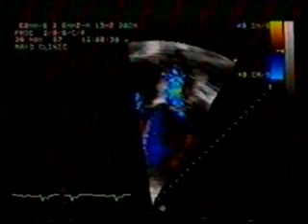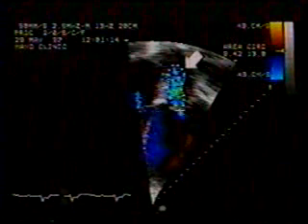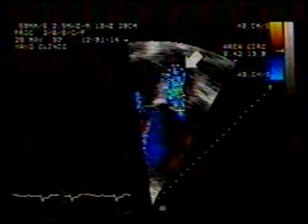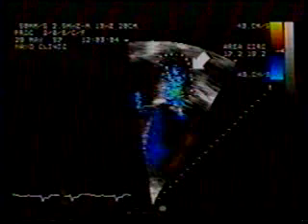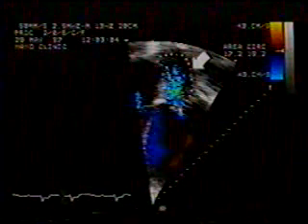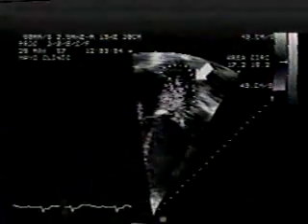In their analysis of 147 patients by flow imaging and left ventriculography, they measured the regurgitant jet area and calculated the ratio of this area to the left atrial area. Since these regurgitant jets are three-dimensional, they calculated this ratio in three orthogonal planes.